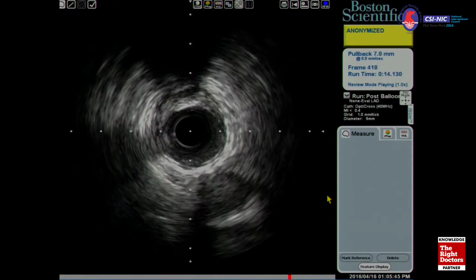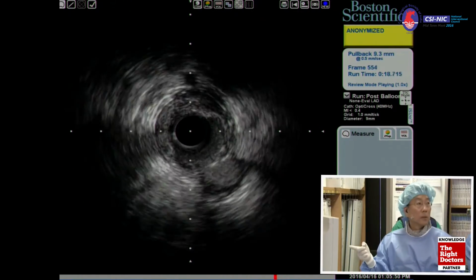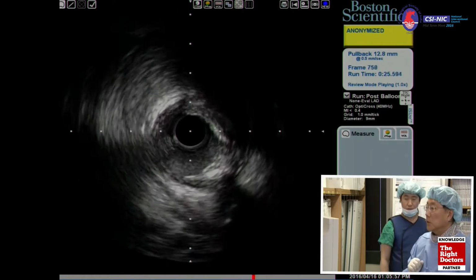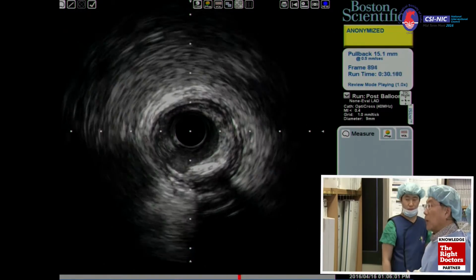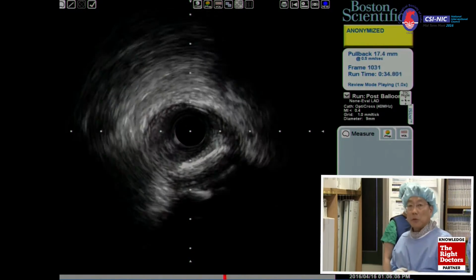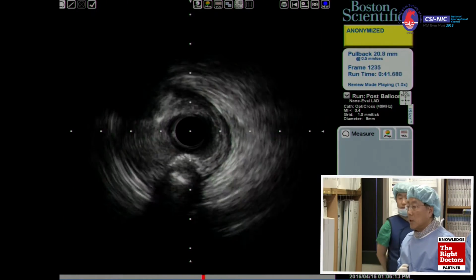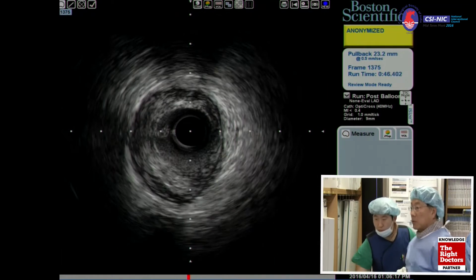Less than 3.0. Is that after the diagonal branches? Yes. So getting bigger, a 3.0 vessel with diffuse disease. We have a lot of information from the IVUS. The reason why we prefer IVUS is that it is almost a main bifurcation disease intervention. Okay, a big diagonal branch coming in from the 1 o'clock. There are big vessels. Oh, some ruptures here, right? Stop.